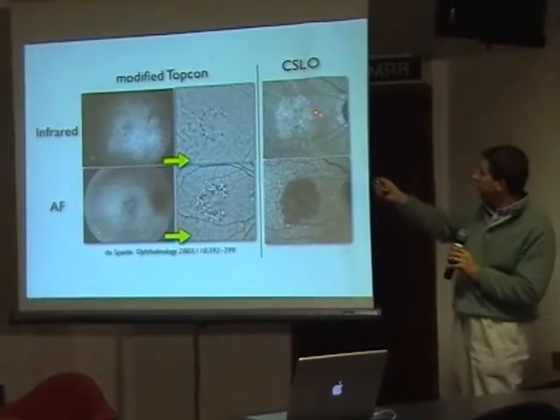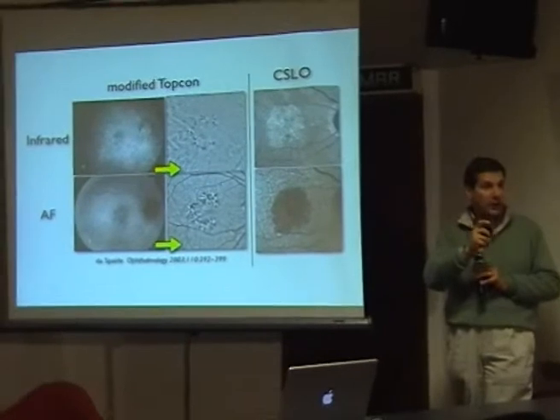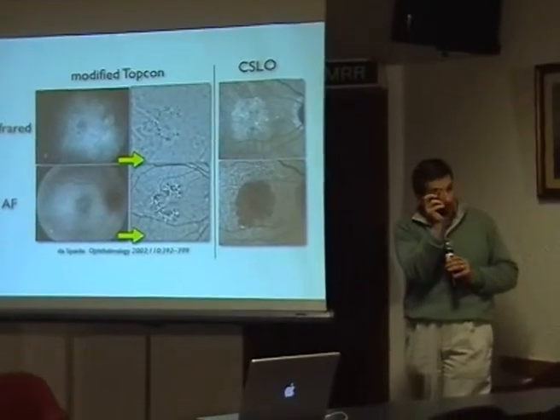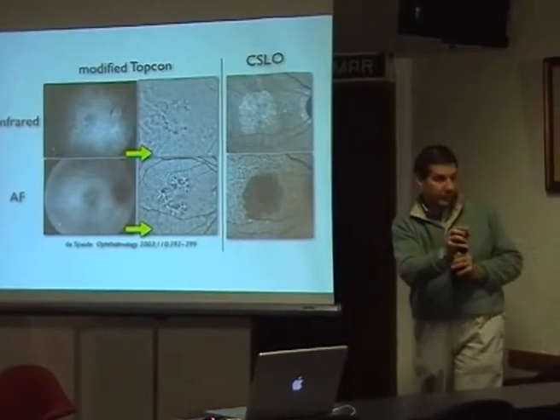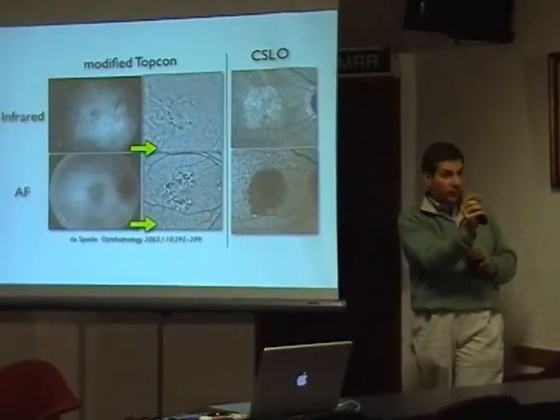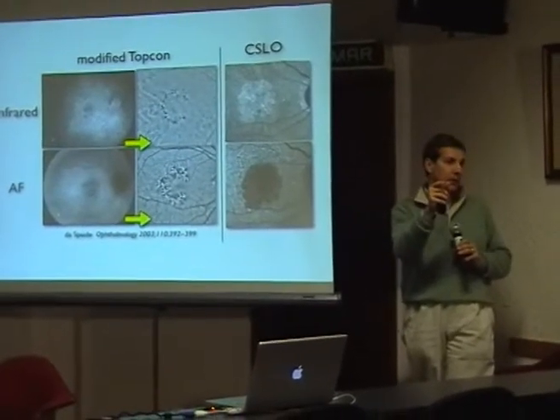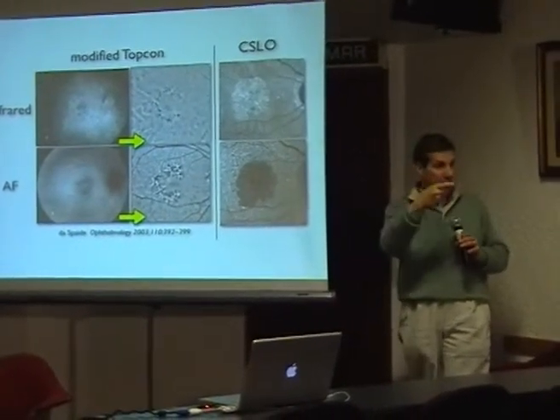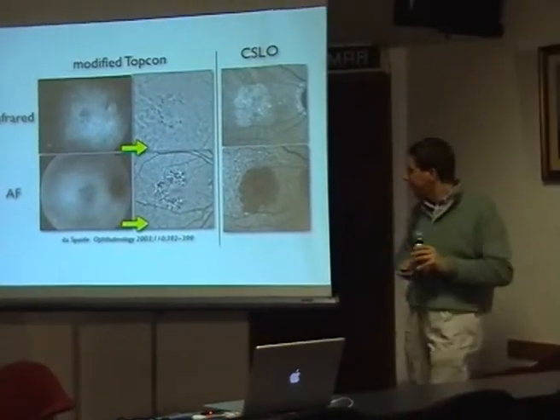In fact, if you take a confocal laser ophthalmoscope where we use a very narrow light, it means it's created by laser, so 488 plus or minus 1 nanometer. Here you see a white light with a filter, so it can be a broader band.